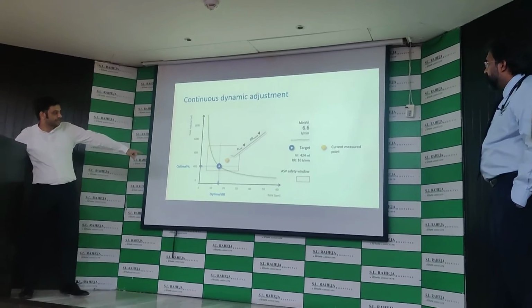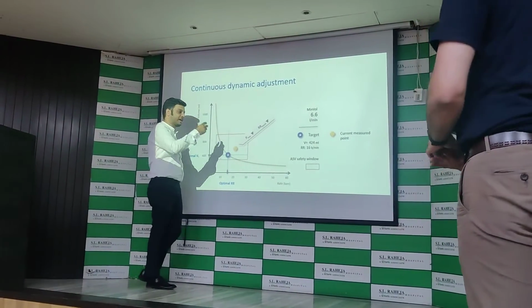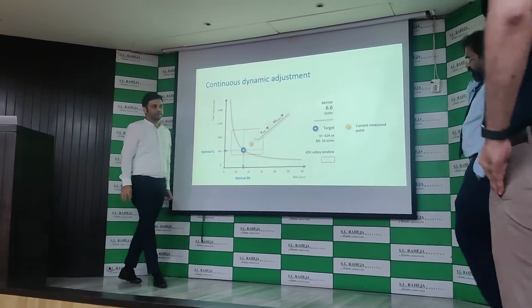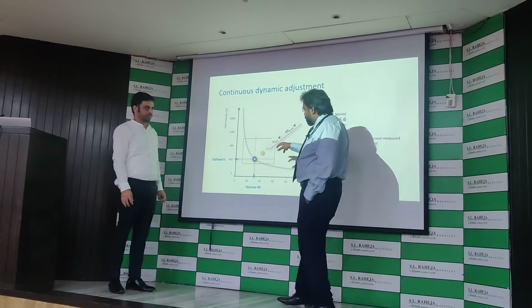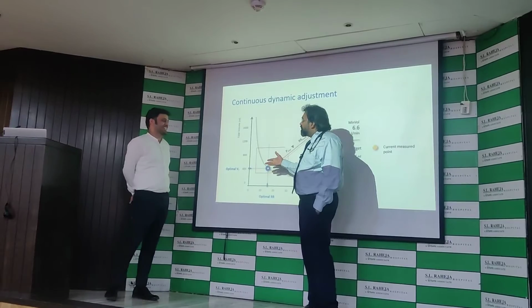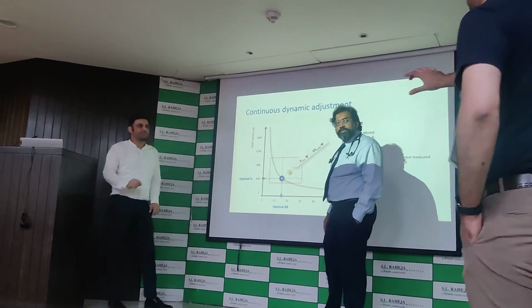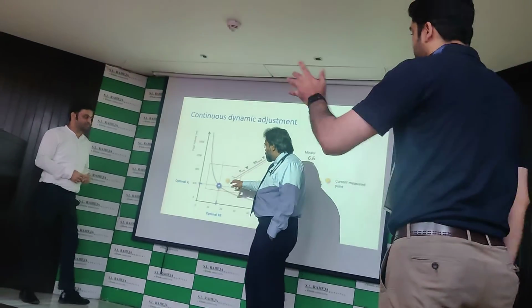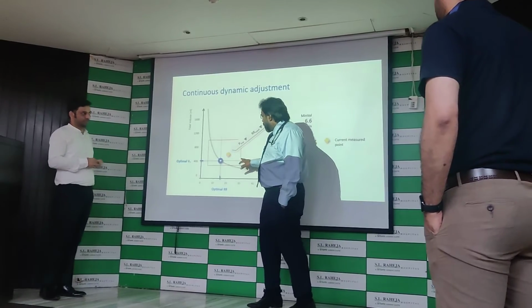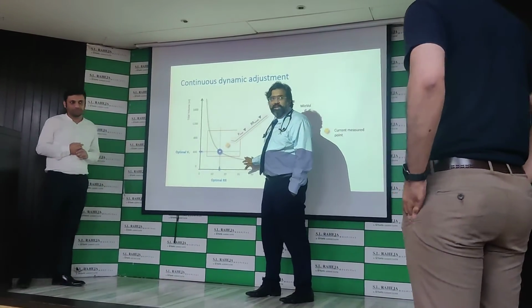This plus sign, and there's a target. So whenever you change, the machine will try to come and meet this target point. What I'm trying to tell you is, I am not looking at this point. The machine is looking at this point. If I have to look at this point, then it defeats the purpose of adaptive support. As per when you change, we don't try to do matching of this. The machine changes the settings automatically based on the actual target. If the point convincingly comes outside here and does not come back here, it means there's something wrong with the patient. We need to quickly take care of this patient.